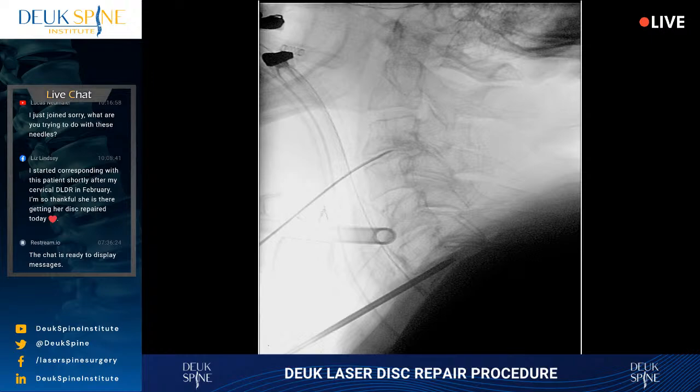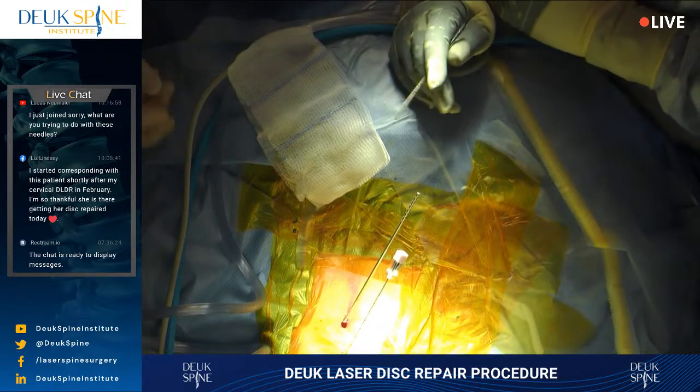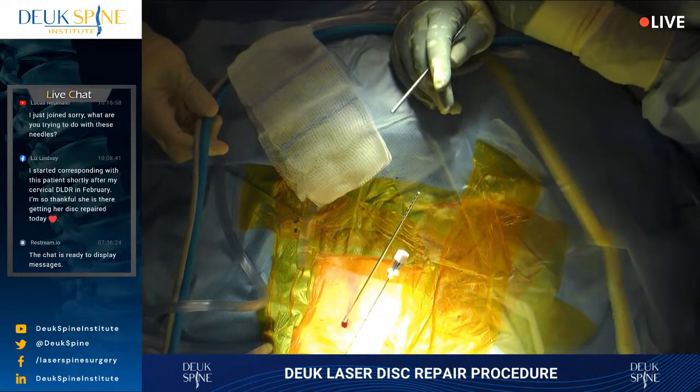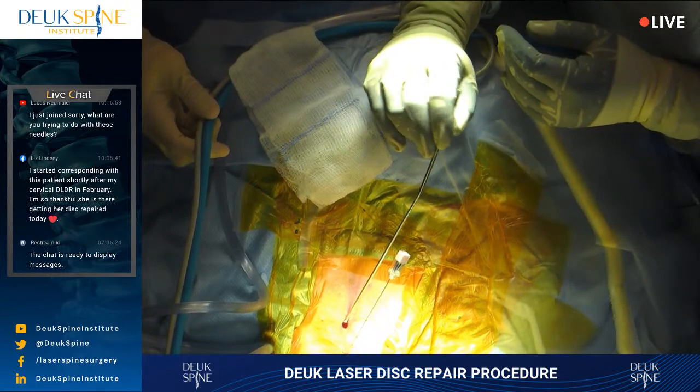We are repairing 2 herniated discs, 5-6, 6-7, and then we're going to come up here and repair 3-4. Okay? So I've kept my eye on the 3-4 needle, make sure it hasn't moved in or out, and it's in good position. So right now I'm going to focus on fixing the C6-7 disc.